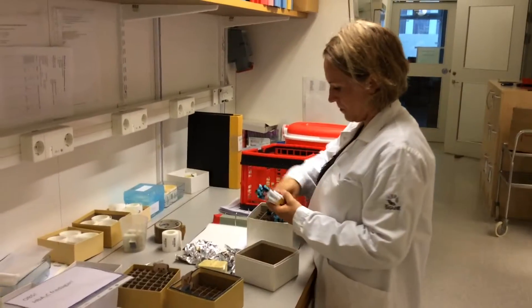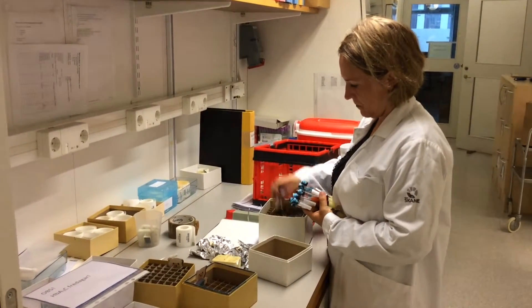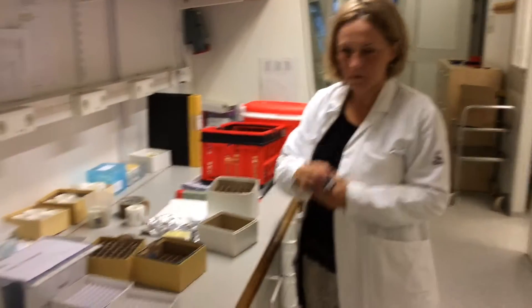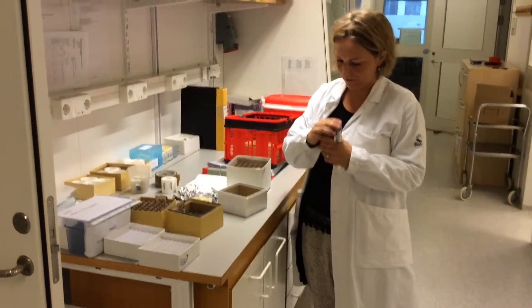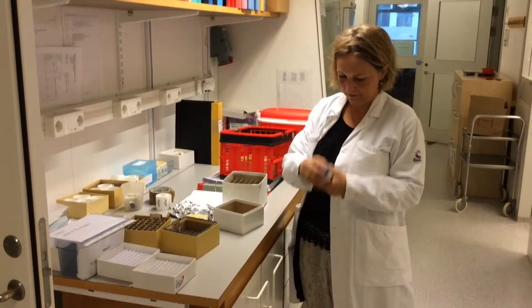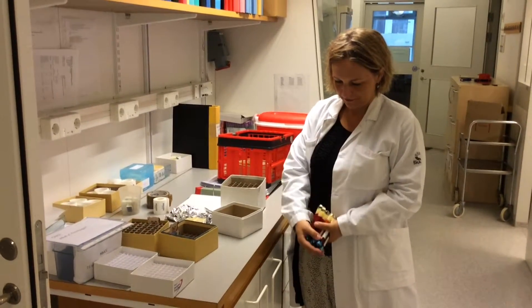Magdalena is taking care of the CPT tubes that will be used for processing of PBMCs. She is now mixing the blood with citrate — that's anticoagulantia — in the tubes.